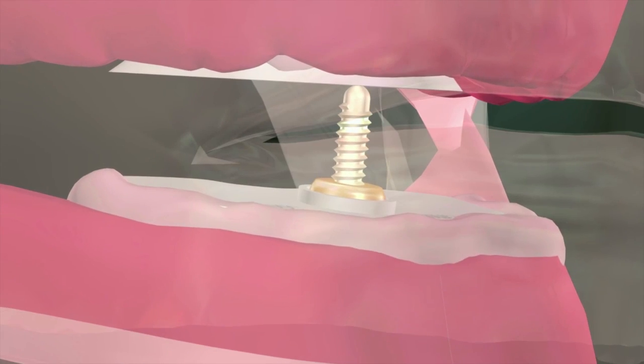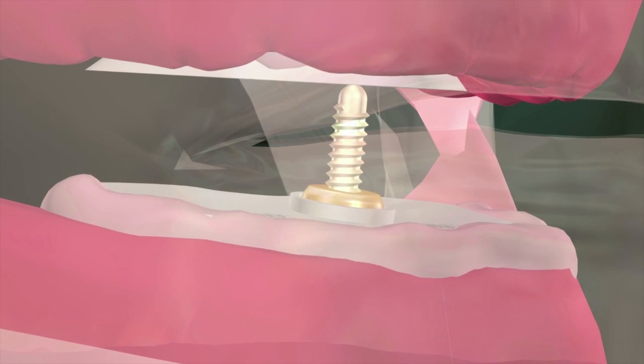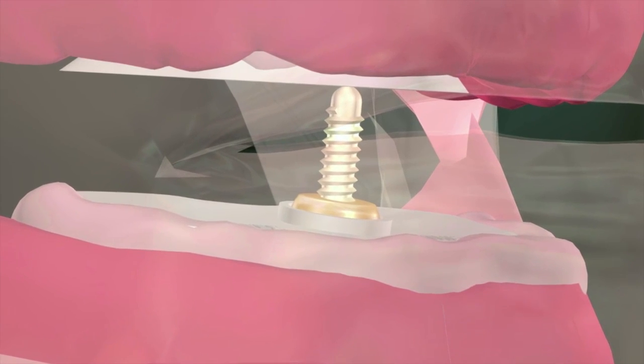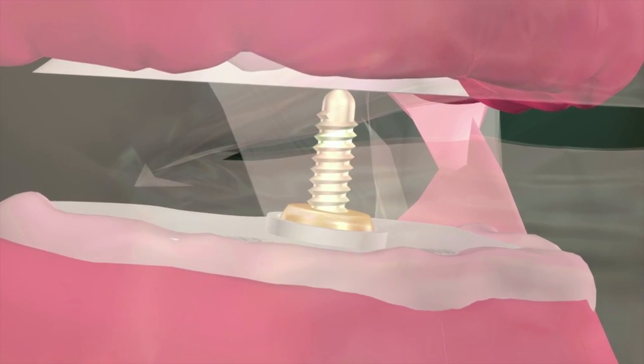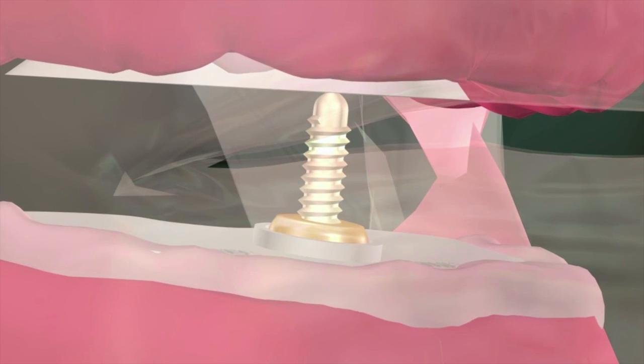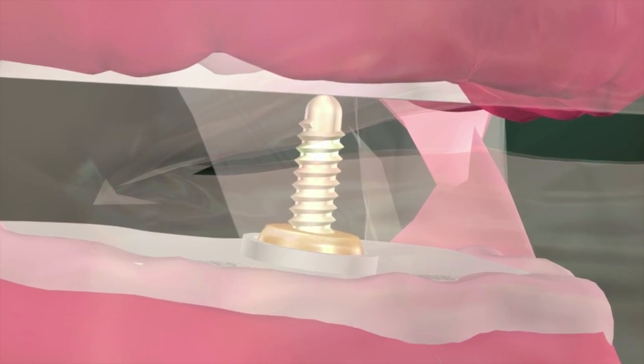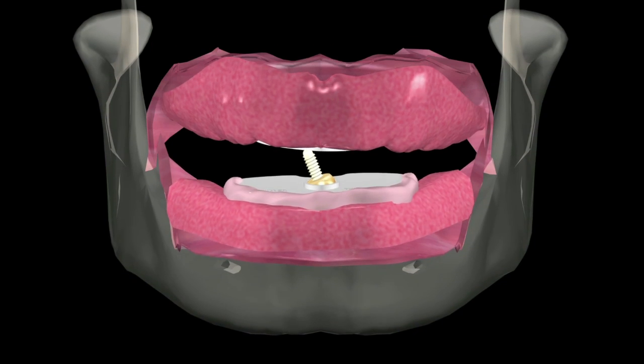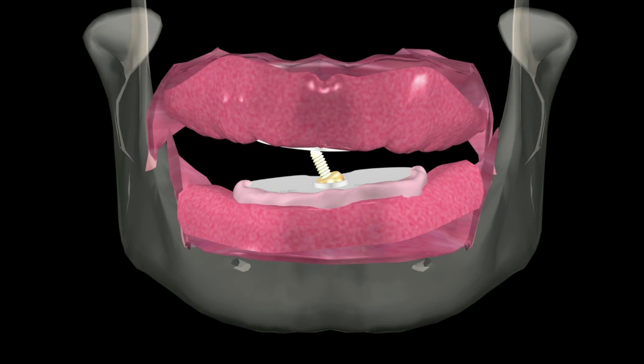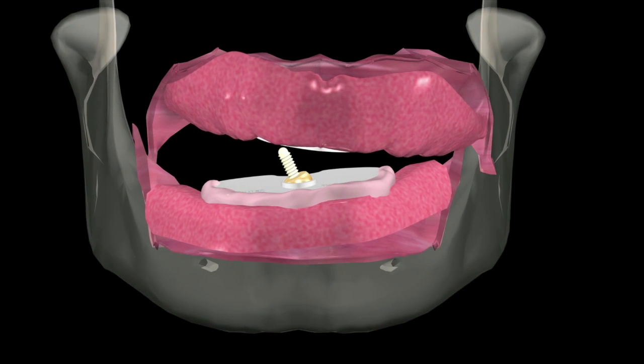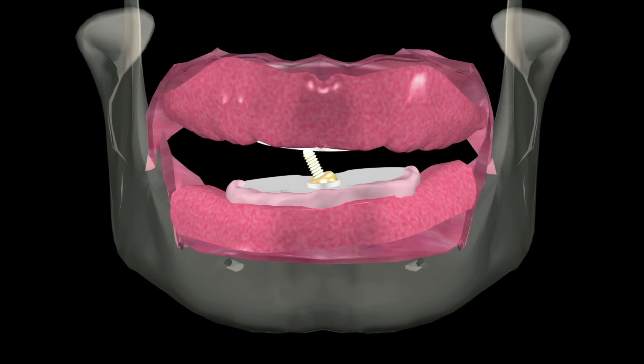A common problem among gothic arch tracing devices is that, if they are not mounted correctly, the pin will not contact the striking plate in a perpendicular relationship. When this occurs, the assembly will not stabilize the base plates. The result is a rocking motion of the plates and an incorrect centric jaw record.